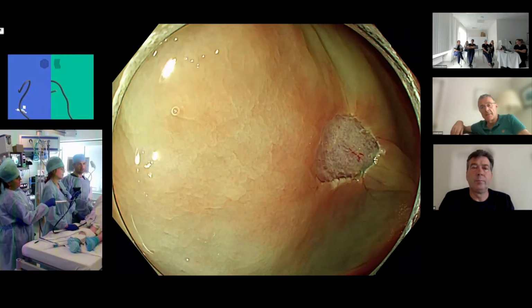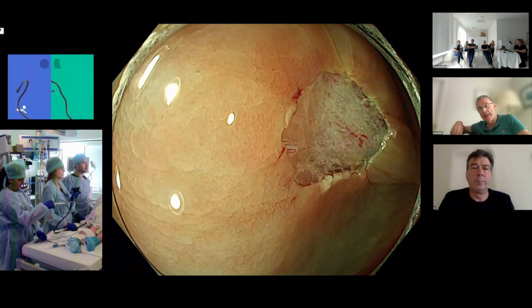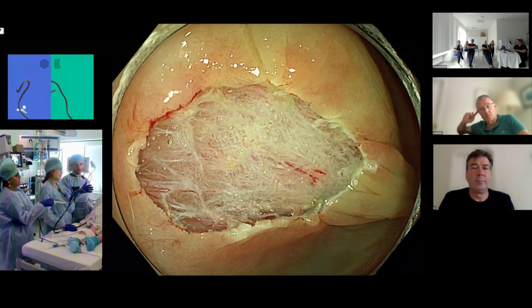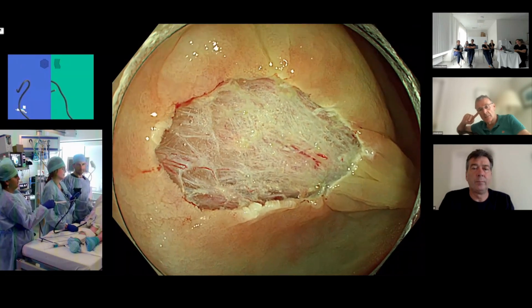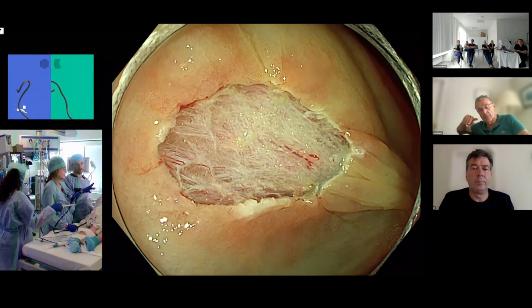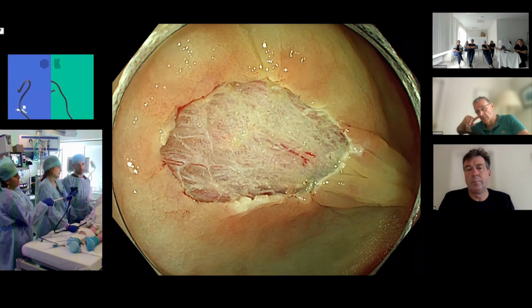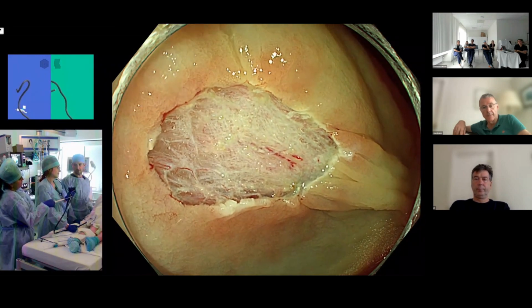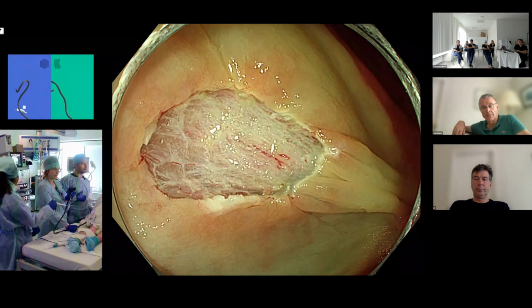So let's talk about the pros and cons of, first of all, STSC. I know that John will be desperate to tell me he doesn't want to do it. What are the pros and the cons? So the negative is that the study does not show a difference with en bloc, because en bloc already has a very low risk of recurrence. But the downside is I watched that snare close right next to the polyp in the majority of the thing. So can you be certain there's no microscopic residual on that margin? And for me, this is an extra protective effect that this patient never gets the recurrence of that polyp ever again. So my personal view is I would do it. Can I prove it yet in 2023? No, I cannot prove it.